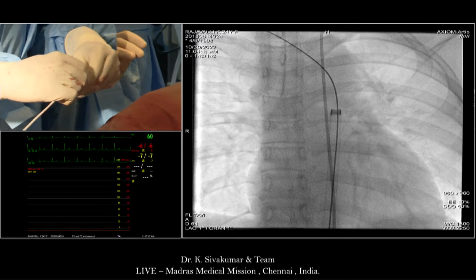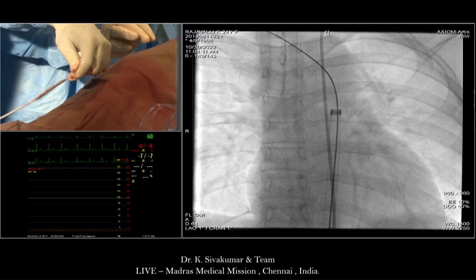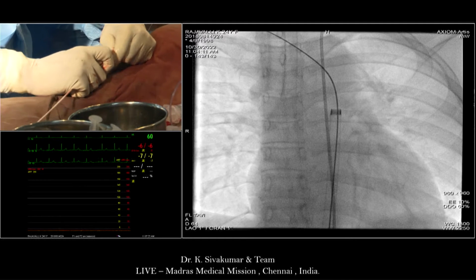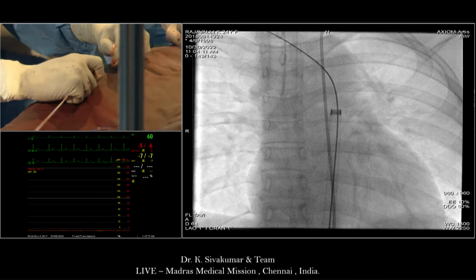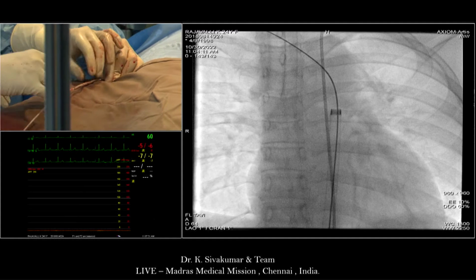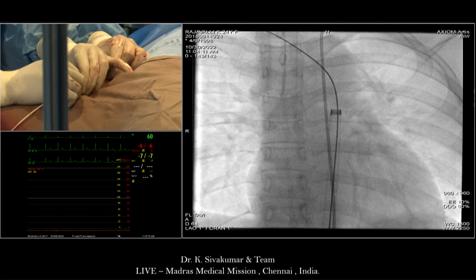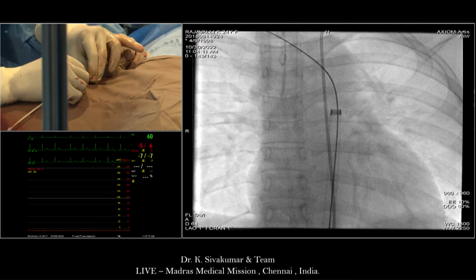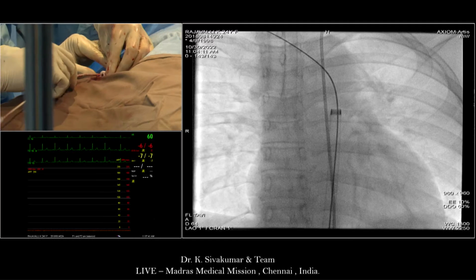Keep it straight, ma. Is it still tight? Even the wire is tight on the wire. So tight. The sheath was tight, now the wire is tight. That's because he was crimping the stent onto the balloon without the wire inside the guide wire lumen.